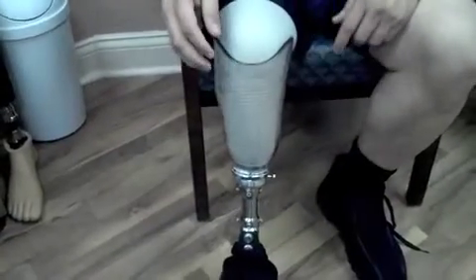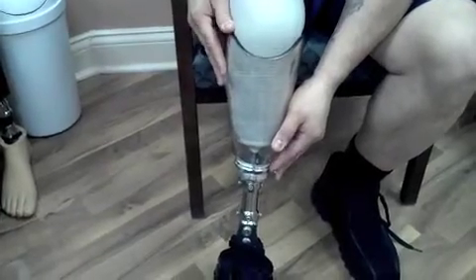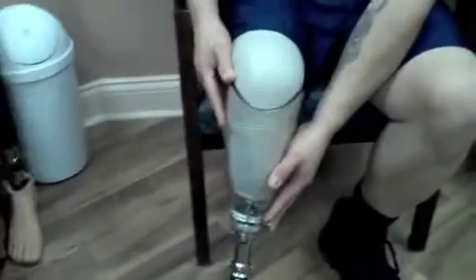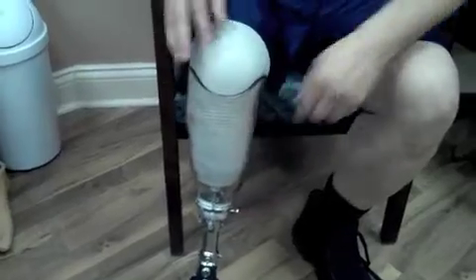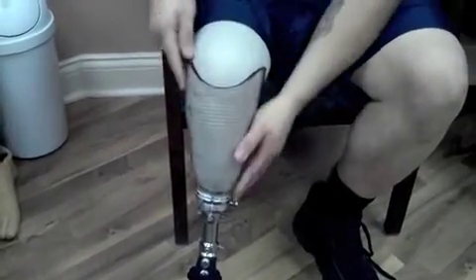Okay, so now pull it back out and we'll do the other one. By pushing down on the knee so the limb goes further into the socket. Just go ahead and push down. And then pull it out one more time.